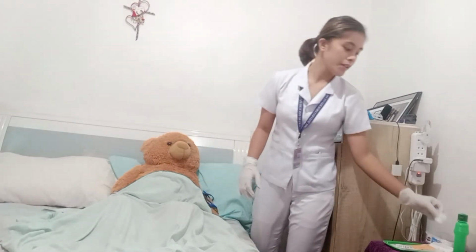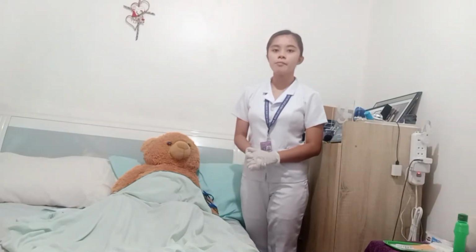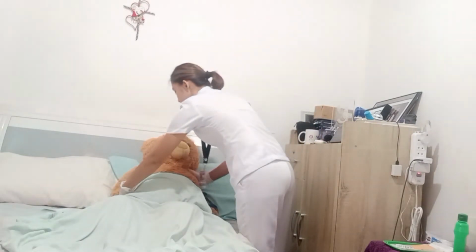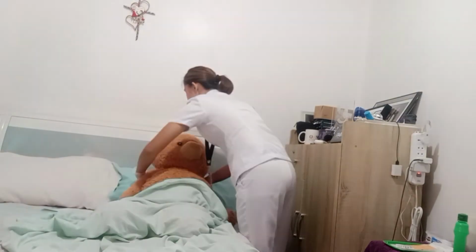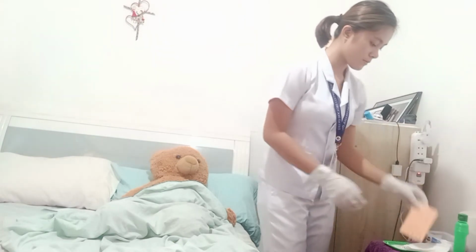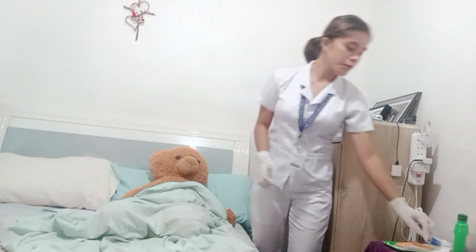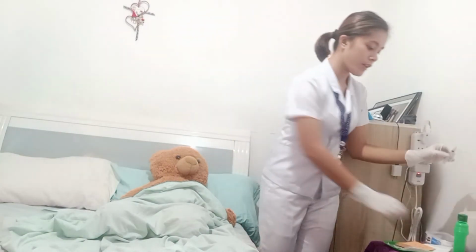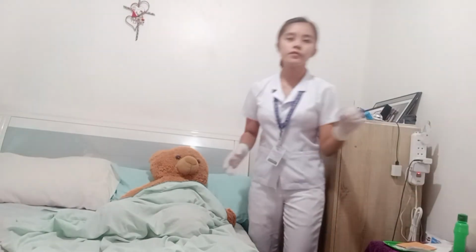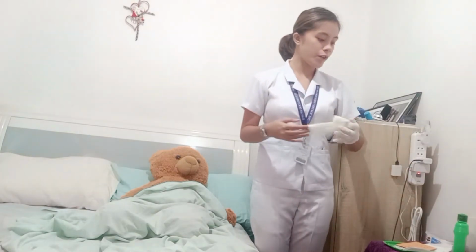Now place the patient in a comfortable position, document the procedure, and record the time and amount of the drug on the medication ticket. Now dispose of the used syringe and the cup in the waste receptacle to avoid needle prick injury. Now I have to remove my gloves and perform hand washing.